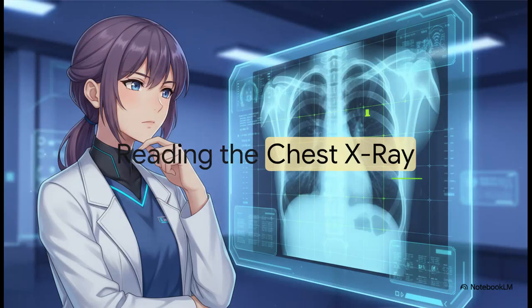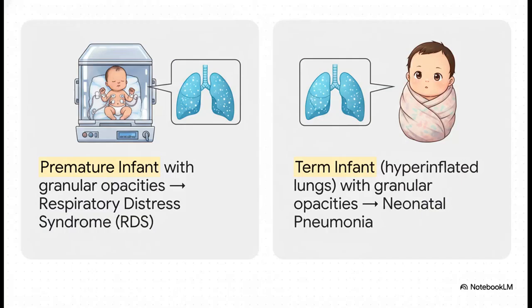Okay, first up, reading the chest. Here, clinical history is going to be your best friend. If you see granular lung opacities, age is everything. For a premature infant, it's RDS. For a term infant, pneumonia.